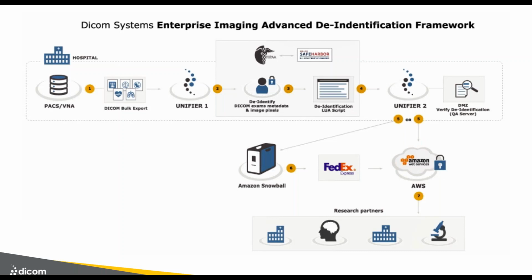And again, like Florent mentioned, we assisted in doing that in a way that didn't disrupt their normal clinical operations. And that was sent to one of our Unifier appliances. That Unifier appliance's main function was to perform de-identification of the metadata in the DICOM headers per the spec that was provided by HSS. There's a very detailed, and we'll see later on how detailed that can get as far as the customization of the de-identification solution.